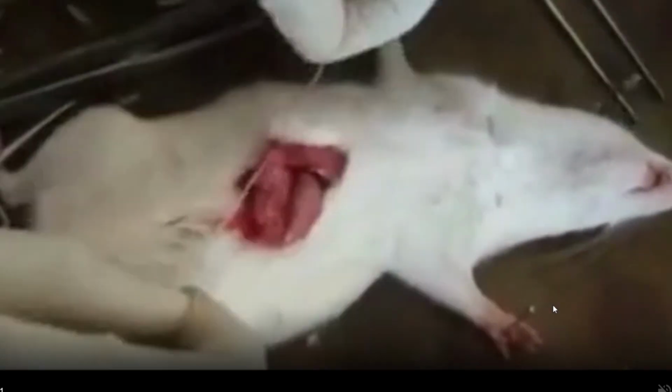Because of the ligation, whatever acid is secreted for the next 19 hours will accumulate in the stomach. Now we will suture the wound, the incision part. So here you can see the video of how to suture the wound.